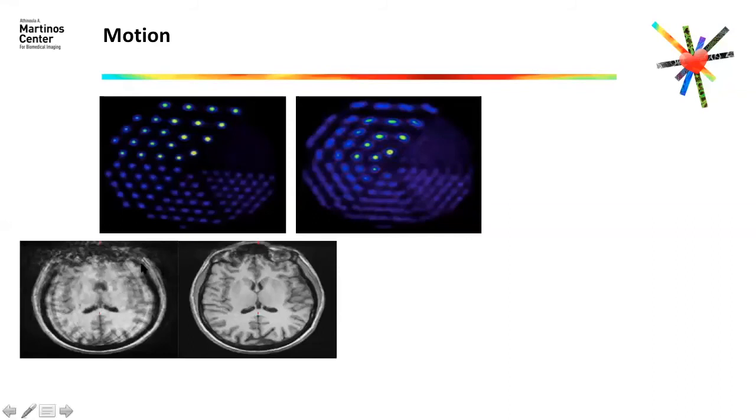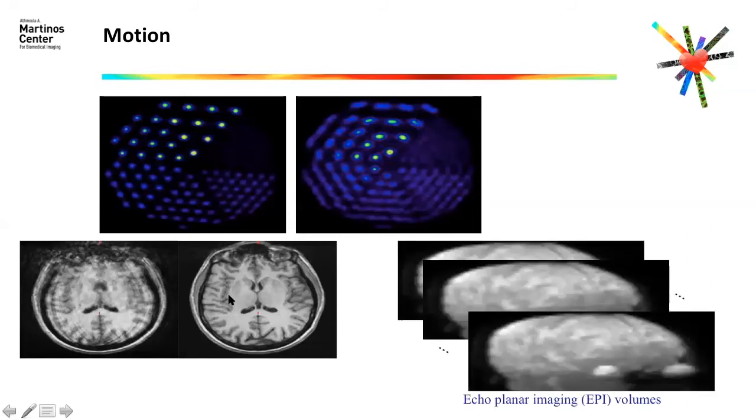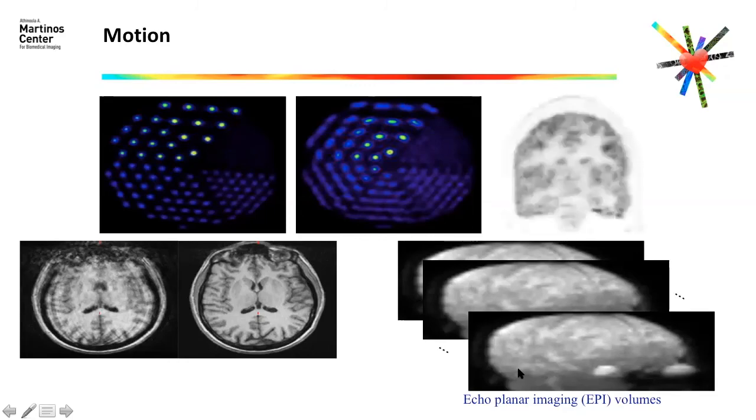So that also happens in the MR images, yes. But we can correct for that in MRI by using, for instance, EPI volumes, very fast volumes that can be acquired every second or every 2 seconds, and we can register those volumes together and correct for that. So the new MPRAGEs, for instance, which are volumetric images acquired in 5 minutes, use these EPI navigators to reposition the image and acquire a motion-free image. So we can use the same information from these EPIs in order to correct the PET image.